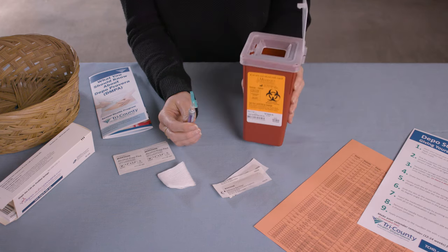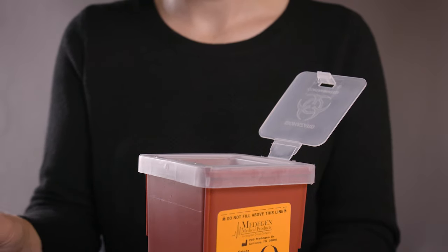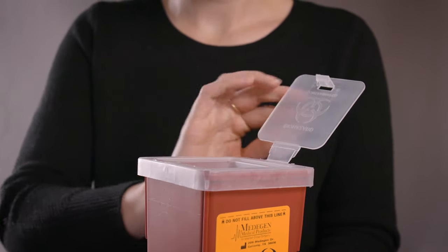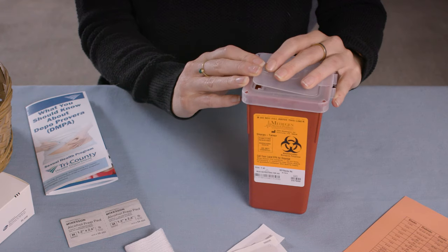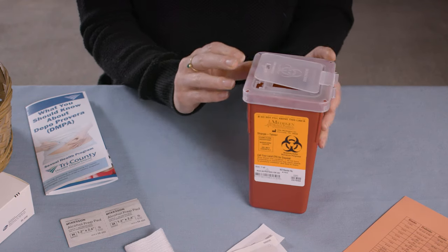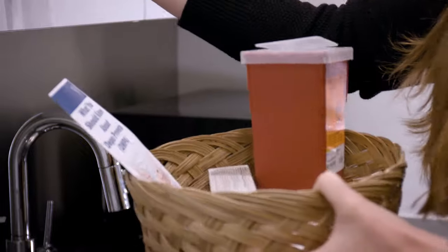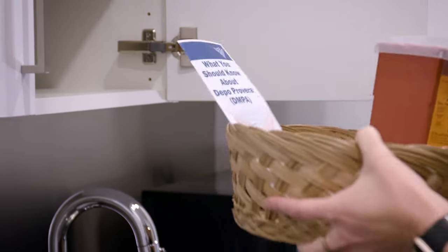Next, your empty used Depo Sub-Q syringe and needle should be placed into a safe container. You can use the same container when you need to dispose of your next Depo Sub-Q syringe in three months. Store the container in a safe place away from pets and children.